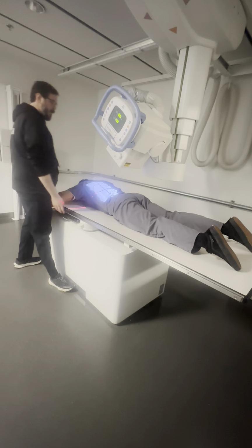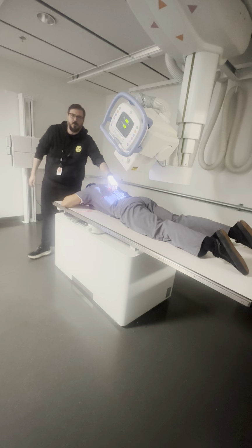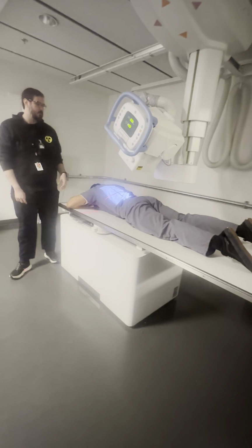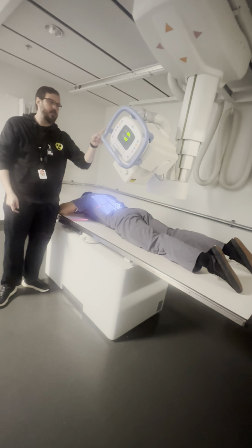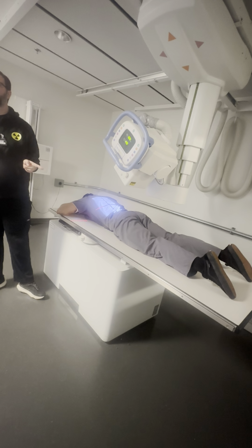Same thing where I want to have the spine on one side, the lateral skin margin on the other, and I shoot up to see the fundus and cardiac sphincter, right? Those are going to be the 4 shots for the UGI. Pretty straightforward, right? They're not that different from the esophagram. This is the tricky one. And this is the one where everybody kept failing their comp last time I taught this.